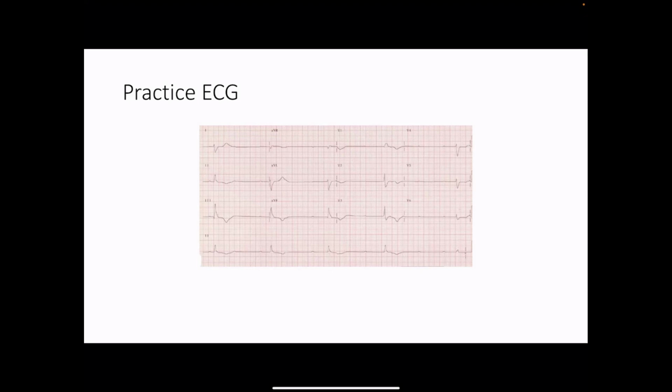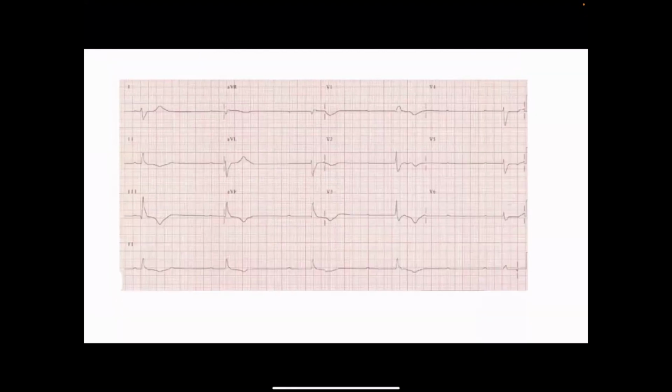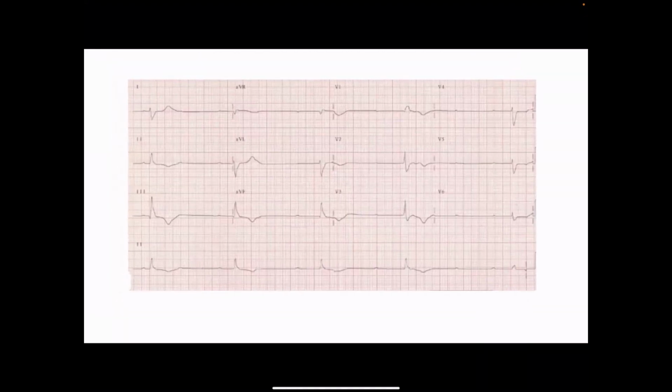Is this a junctional rhythm? No, but I see why you would think that. Third degree. Sorry? Is it third degree? Yes, it's third degree. It's very faint. The ECG is very faint, so you can't really see. Yeah, this isn't the best ECG.